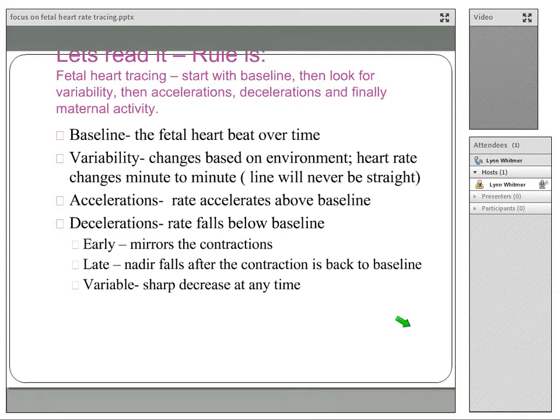So I'm thinking if the cord happens to float into their hand, they're going to squeeze the cord. As they squeeze it, of course, they are cutting off their air supply. And once it cuts off enough, they'll get comfortable, they'll relax, and they let go. Now, I can't show that in literature. I can't prove it. It's just one of my theories. So when you see the sharp decline of fetal heart rate, you know that it is a cord compression.